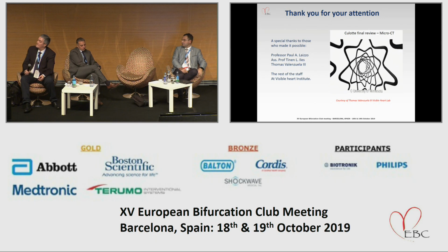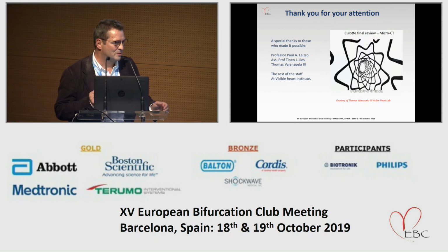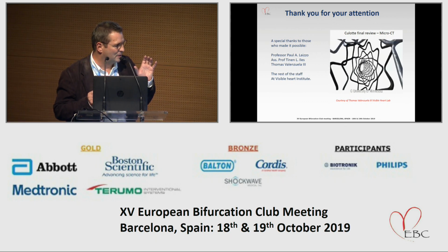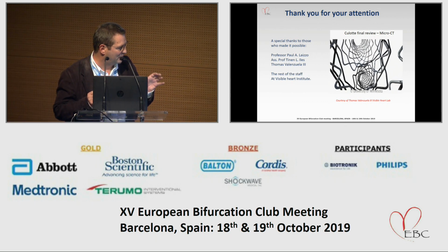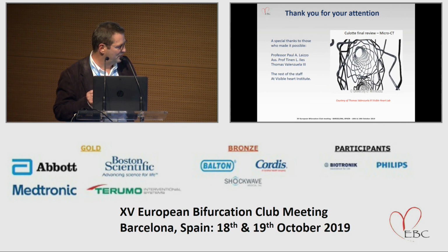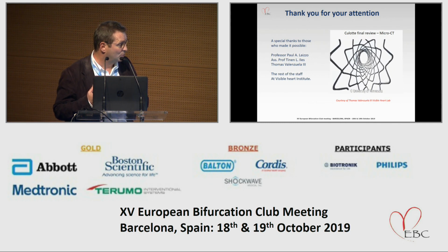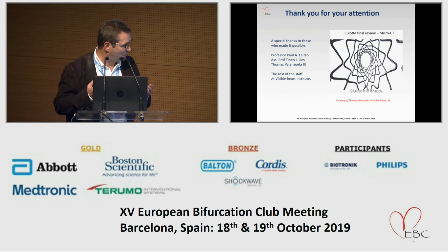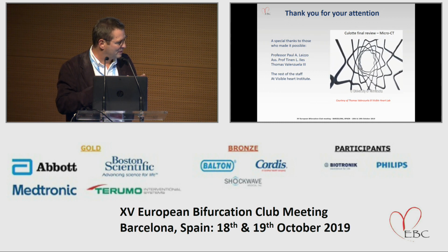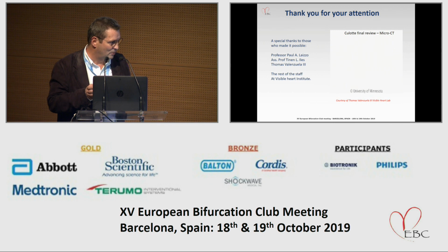Well, we need to do a lot of teaching and we need to have a lot of meetings. But I think actually what happens is when you have the X-ray imaging and the normal angio guiding, you are not able to see these things. So you have a perception in your head of what is happening, it could be wrong. But you think so because the final result is nice, and you won't see the stenting, the floating struts, and you won't see all these things.